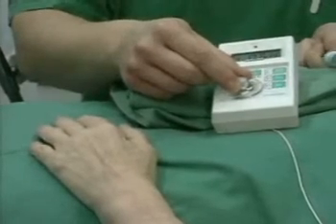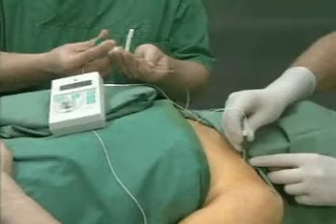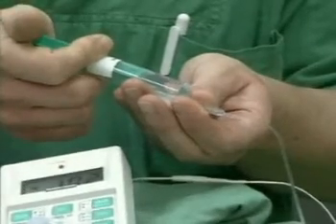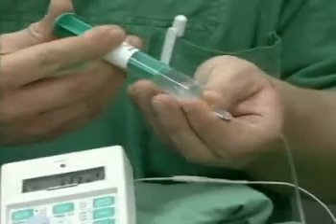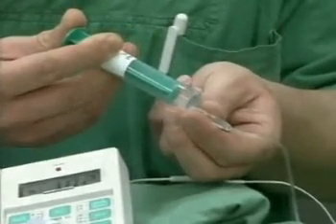If the contractions remain visible, 40 milliliters of 1% prilocaine and 10 milliliters of 0.5% ropivacaine are injected with repeated aspiration tests. The development of a complete blockade occurs in 5 to 15 minutes.